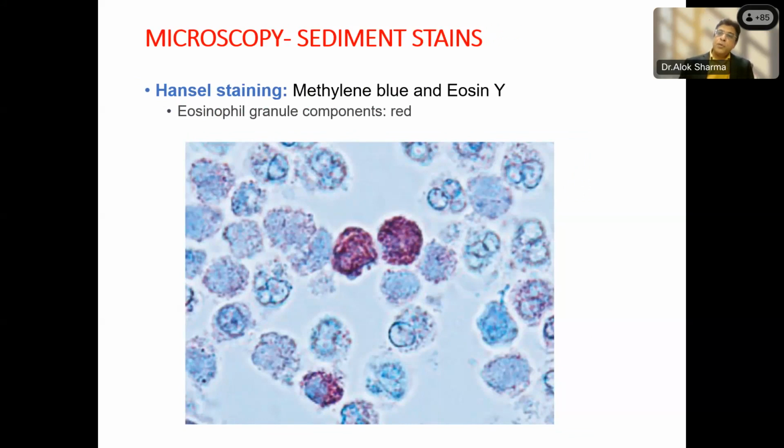You remember I also spoke about eosinophils, right? It's an important thing. One specific clinical condition I gave you an example of earlier: you'll get requisitions from the cath lab or the cardiac surgery unit telling you to please look for eosinophiluria. That's the most common requisition you get there. So in those cases, it is not a bad idea to do a Hansel stain because you are looking specifically at those cellular elements, and you can identify and quantify them, because these examinations are done serially. Basically, the idea is to exclude atheroembolic renal disease after a procedure.